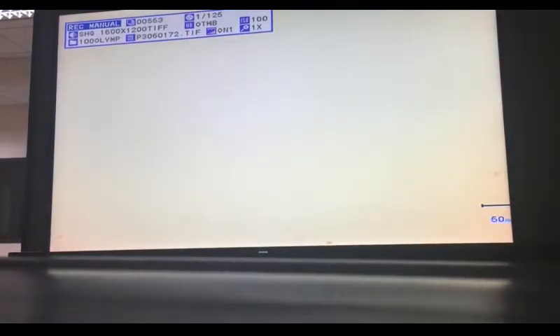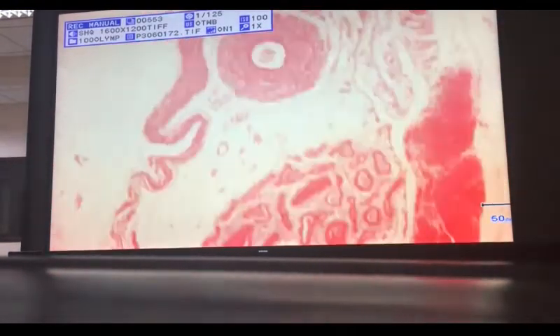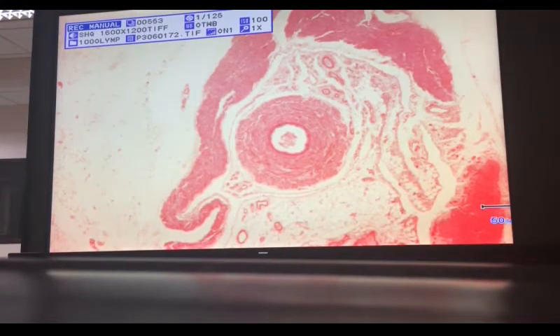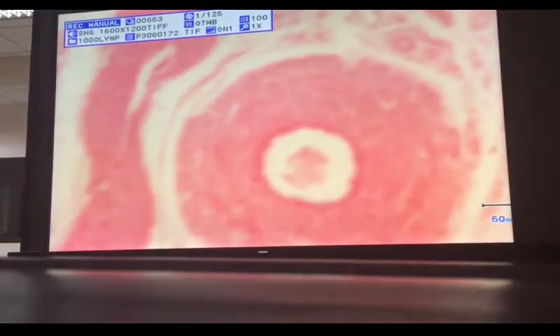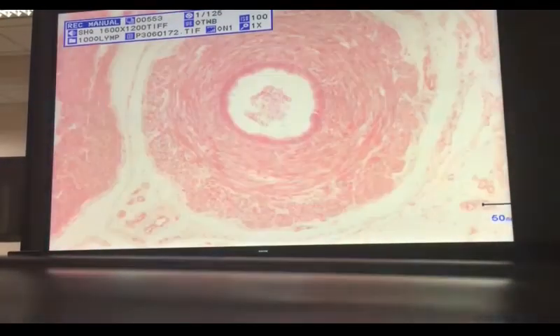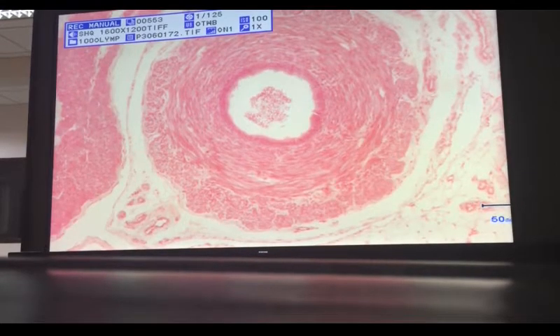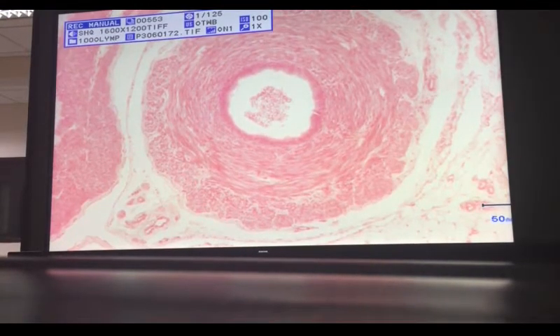Following the epididymis is the vas deferens. Okay. Now, are you familiar with vasectomy? That is the organ that is being tied and cut in vasectomy, the vas deferens. That is why it is called vasectomy. The vas deferens is a muscular tubular organ. What is the lining epithelium of the vas deferens? Still pseudostratified columnar epithelium.